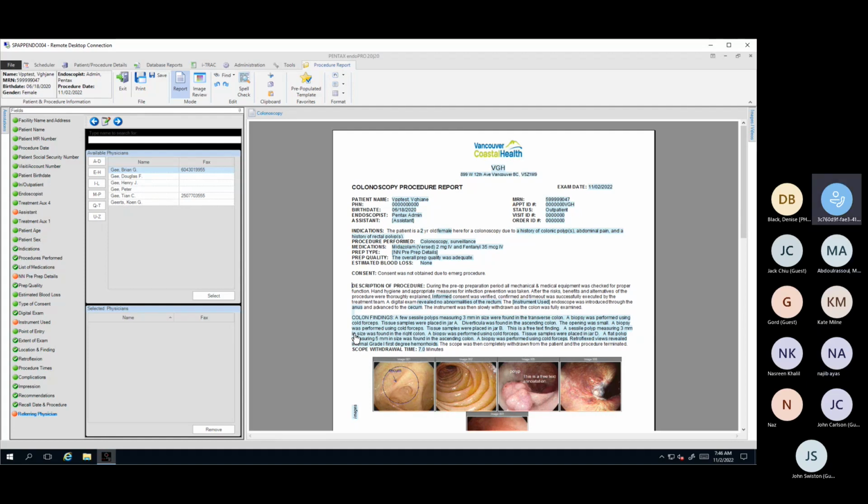Okay. Is there a general comments or additional comments data field? There is not, at least not a field on its own. There are additional comments associated with each particular field, but not a comment field by itself. But again, not at this point is my answer. So it's not something we cannot do in the future.